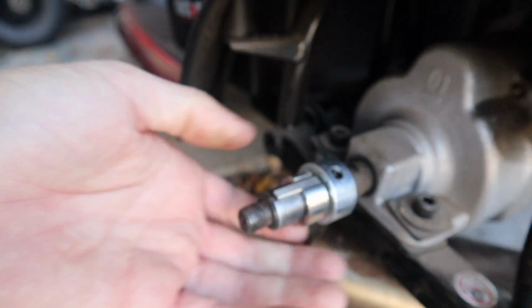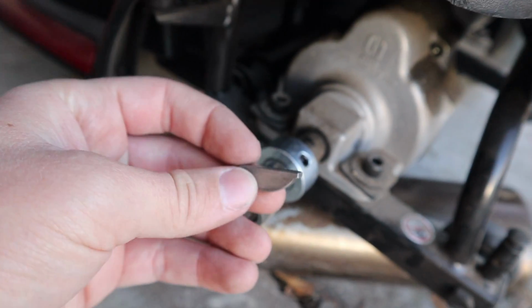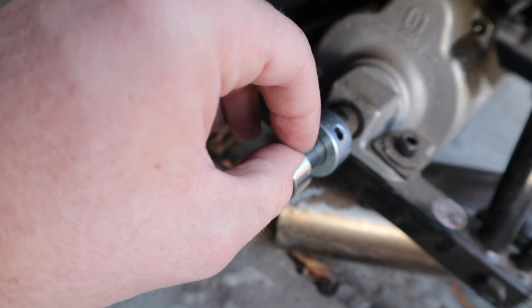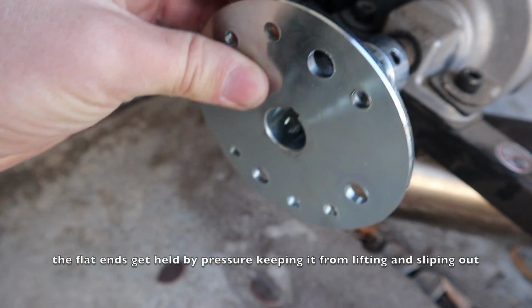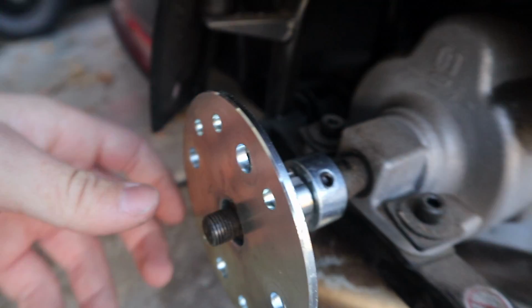And because the key is not completely round, it does have a flat piece. When that flat piece has pressure on it from this hub right here, it's not gonna lift up on that side over there.